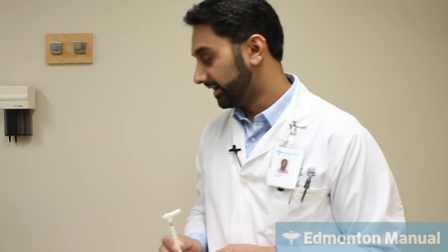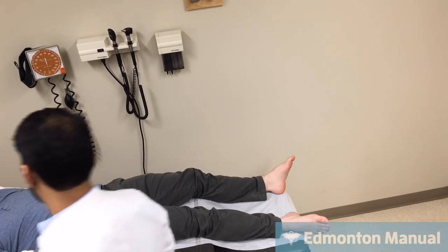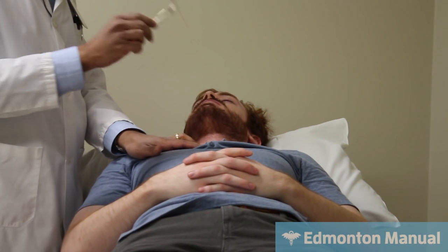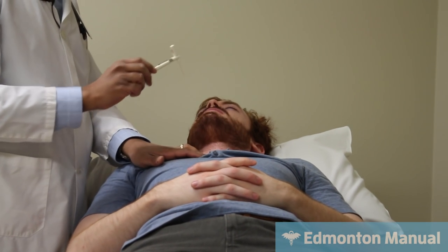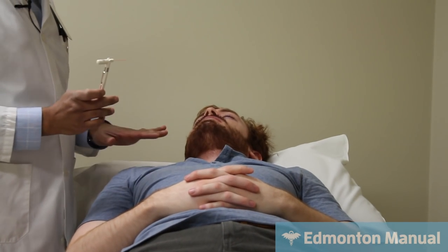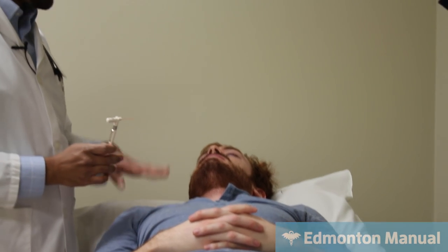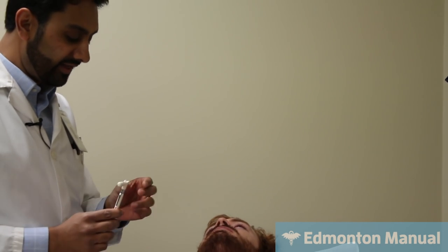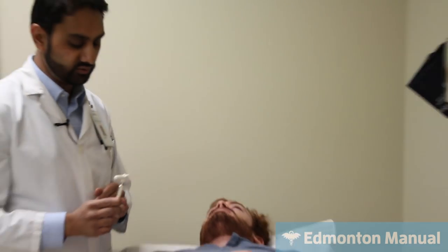So the way you do it is, just like with vibration testing, you want to make sure that the patient can feel it. You actually do it on an area that's very proximal first. So we're going to again head up to the head of the bed, and with our patient, I'm just going to expose your chest a little bit. I want you to close your eyes and tell me that you feel this, okay? Yes. Yes. So he was able to feel it. He knows what it feels like. I want you to remember how that felt, because if you even feel it but less strong, weaker, then that would be very important in terms of the scoring with some of the systems we use to judge it.